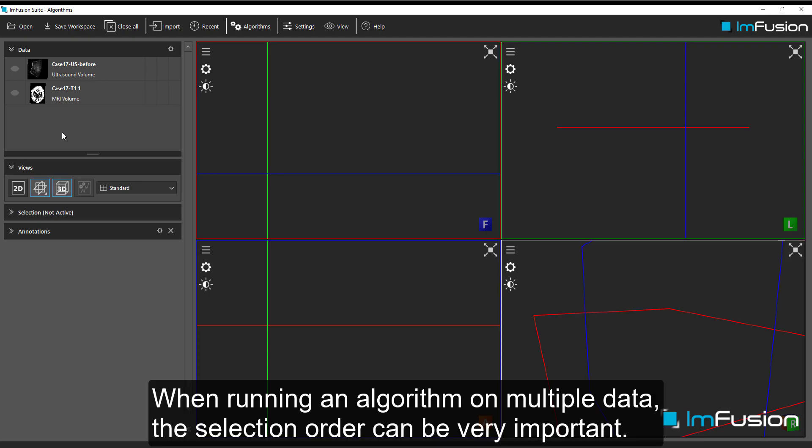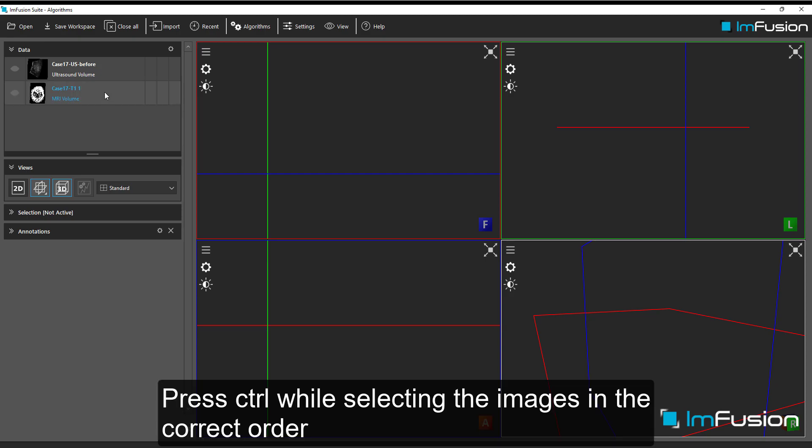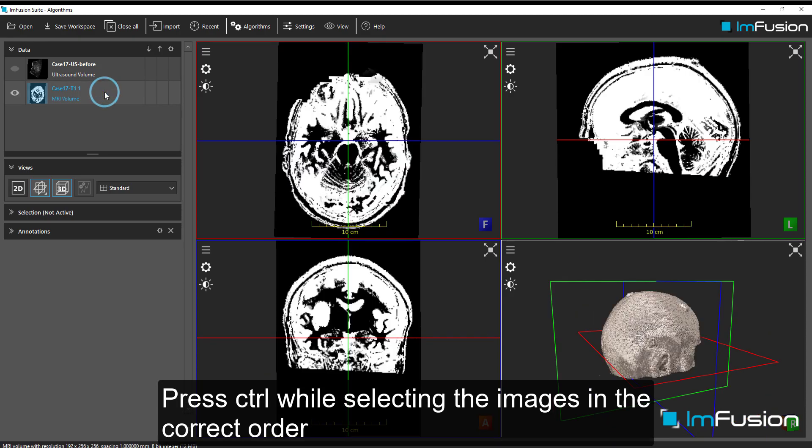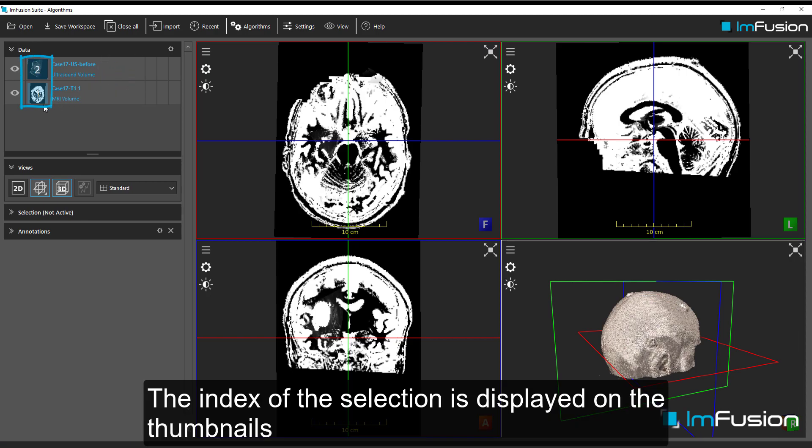When running an algorithm on multiple data, the selection order can be very important. Press CTRL while selecting the images in the correct order. The index of the selection is displayed on the thumbnails.